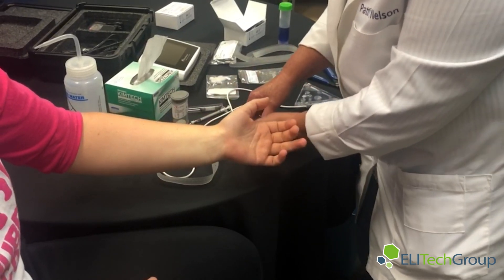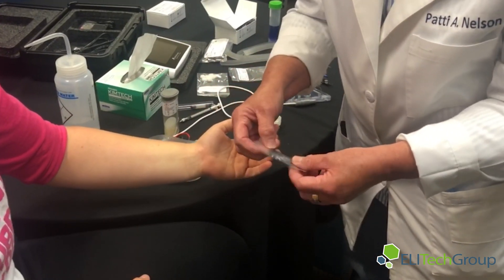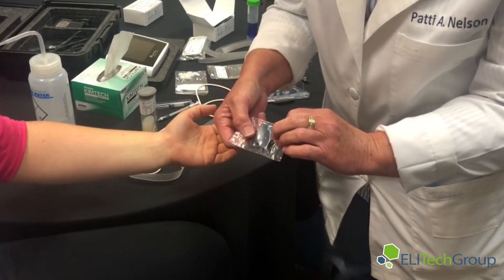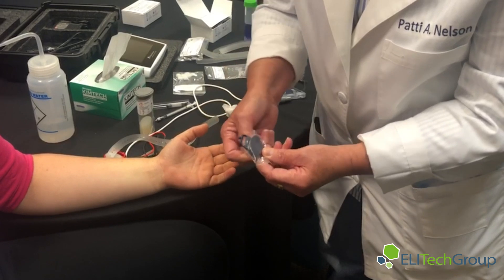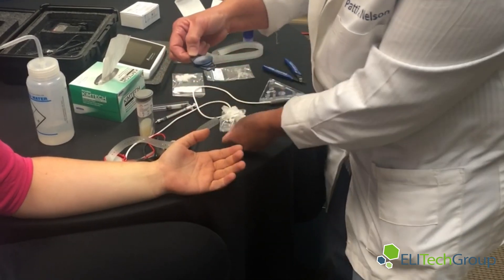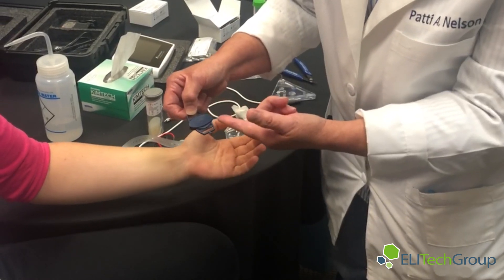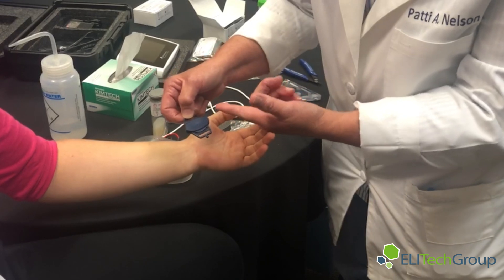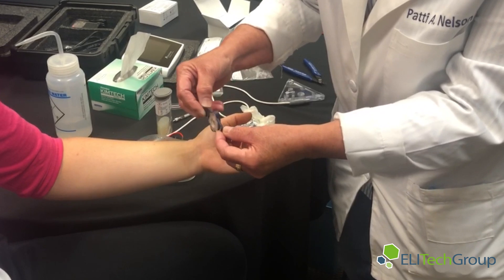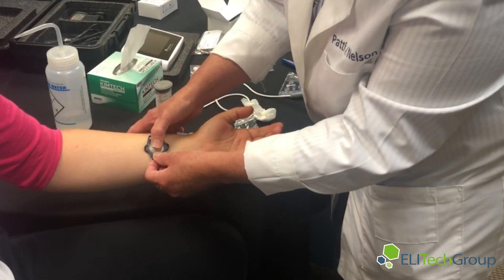One thing you've got to be aware of is with the MacroDuct collector — you do not want to touch it with your hands. Your hands may contain some kind of chloride or sodium. So what you do is remove the collector from the package. You can see there's some blue dye on there, and when the patient sweats, the sweat will pass over that blue dye, coloring the sweat blue as the patient sweats.